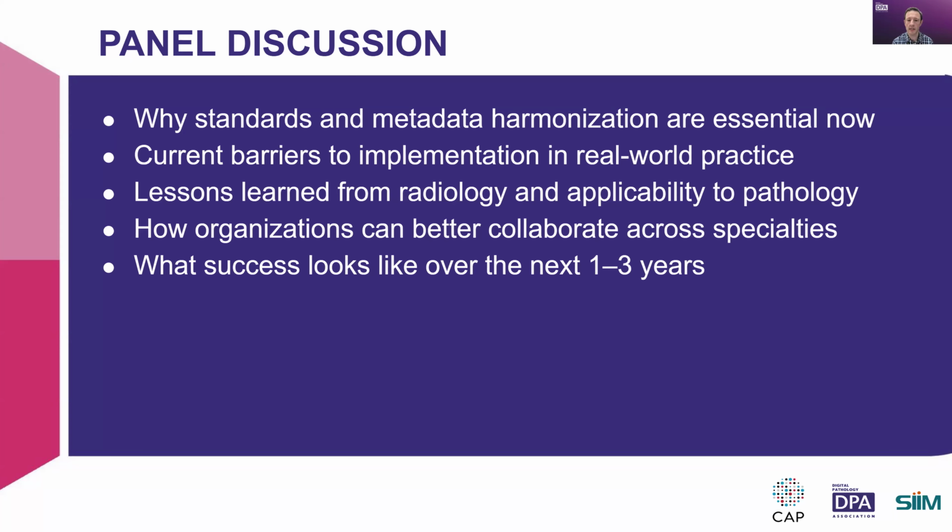And so there's no standardization on those fields across vendors, across institutions. That causes challenges when you want to have imaging across multiple organizations, or when you have multiple vendors in your space. That causes challenges with things like display protocols. But all the data is there mathematically for these things in the DICOM, and artificial intelligence systems can read that information in a way that humans cannot. And so that's why I'm not as sure that's a problem moving forward. It's also very domain specific.